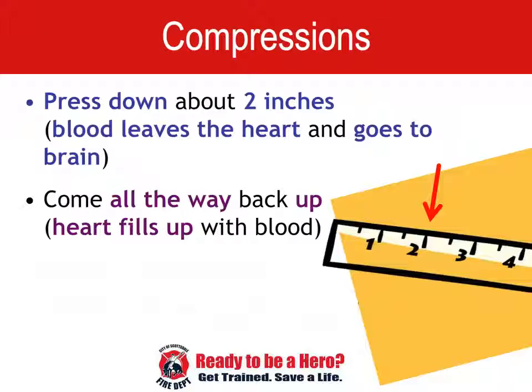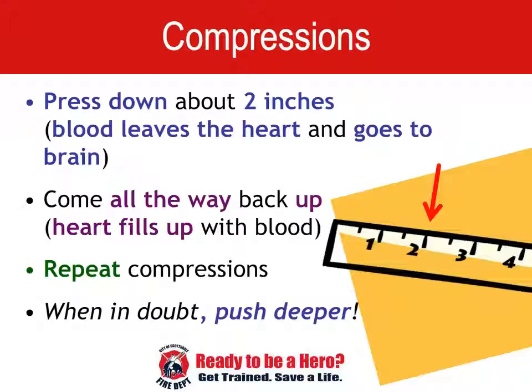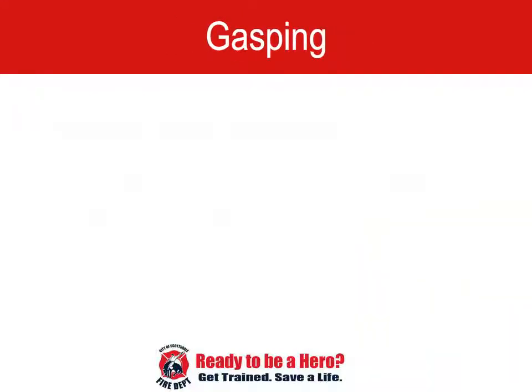Expect to hear a snap, crackle, pop with your first compressions. That is cartilage loosening and maybe ribs breaking. That's okay. We can fix the ribs. We have to keep the brain alive.